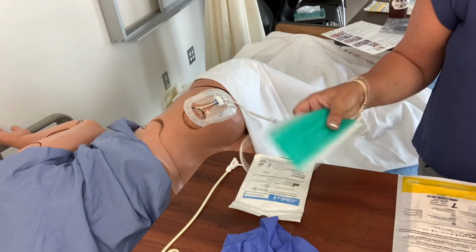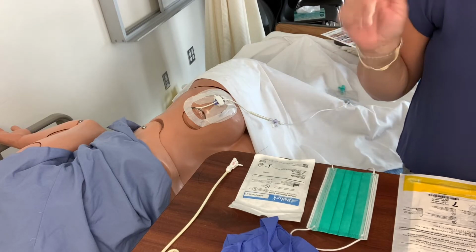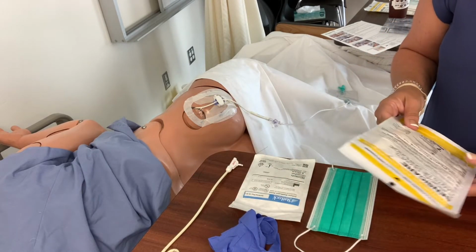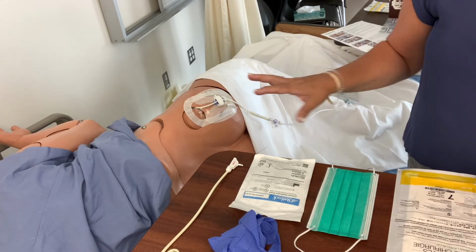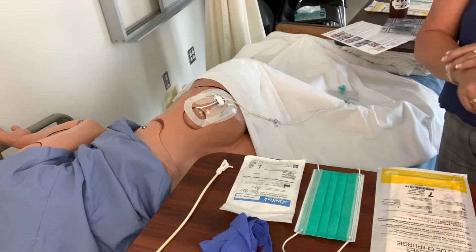I'm going to use a face mask on myself and on the patient. If the patient is unable to wear the face mask, they are to turn their head away from the location. I'm going to use blue gloves to remove the dressing, same as I would on any dressing, and sterile gloves when I'm getting deeper into the dressing change. So I'm going to gather up and set up my supplies and we'll get started.